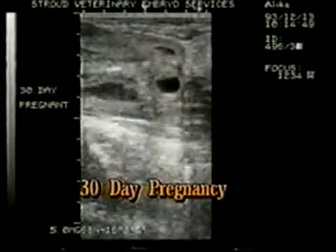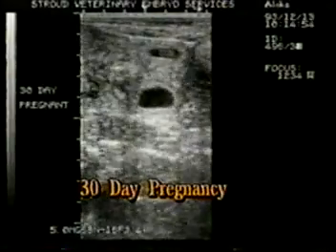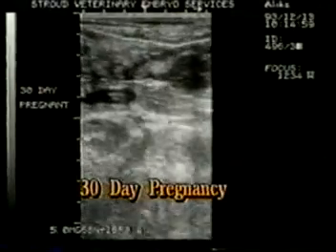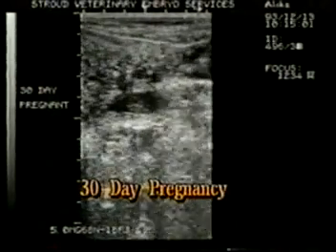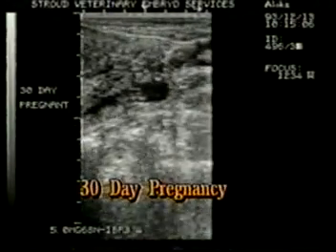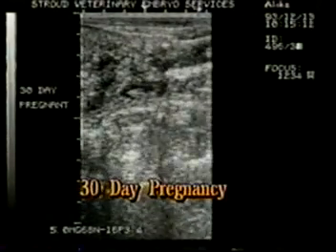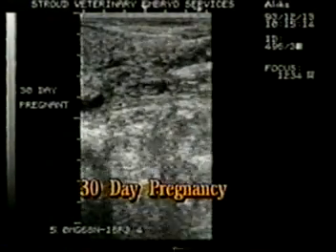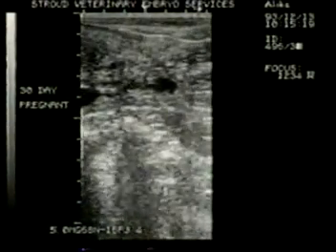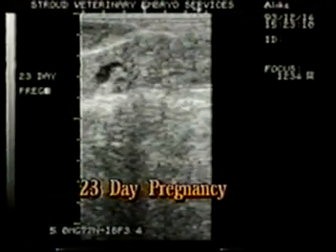A 30-day embryo has a detectable heartbeat. The fluid volume is noticeably less. The 23-day-old embryo is sometimes difficult to pick up with ultrasound. Pregnancy is diagnosed at this stage on presence of amniotic fluid alone.